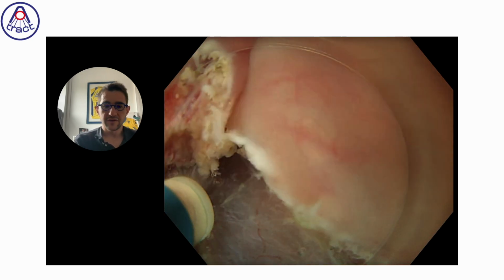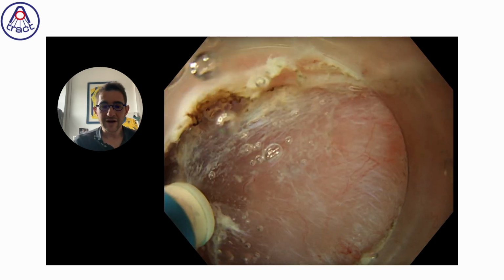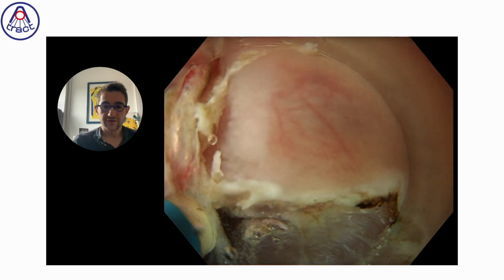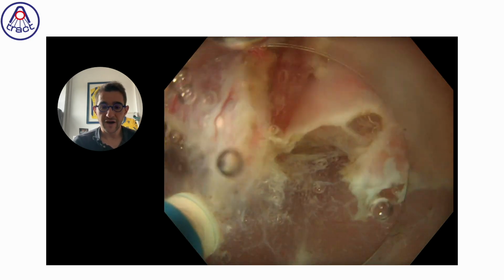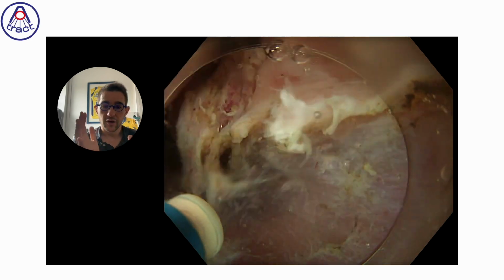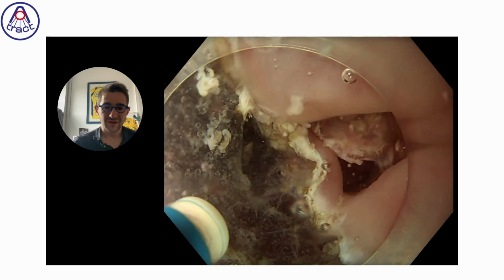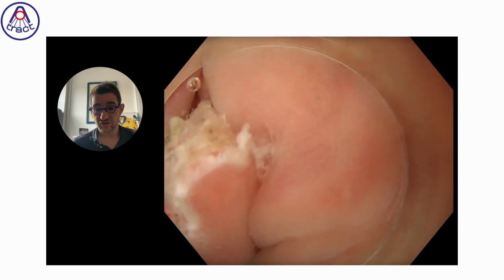So in our unit for supervision, we really usually do like this, I mean small parts of the procedure, because one of the problems of training people is the time of procedure, and therefore it is easier to give the end many times, 4, 5, 10 minutes, but you still have the control on the whole flow of the procedure and therefore the complete duration of the procedure, rather than doing a complete procedure where the duration is more difficult.